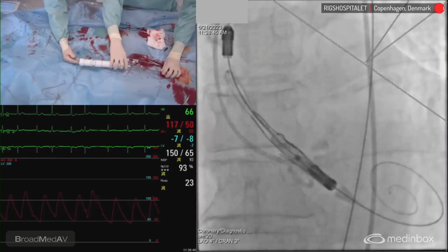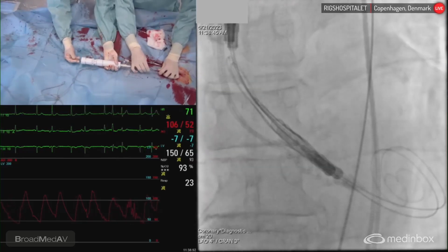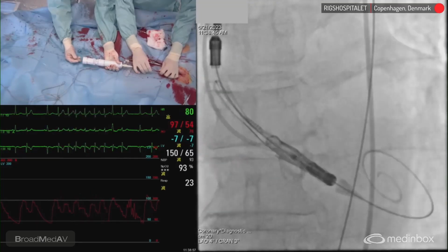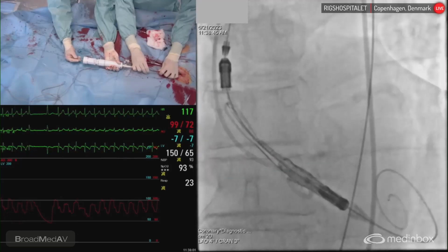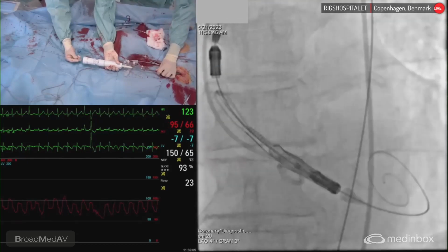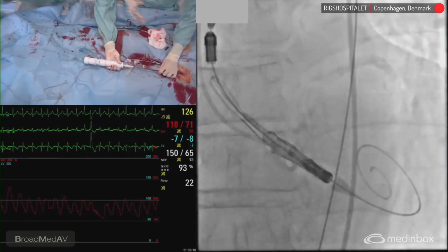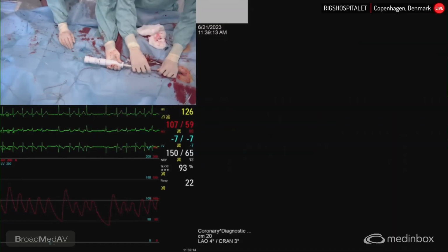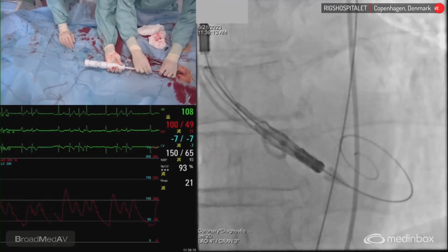All right, so we have to do this correct. You hold it. Yep. Okay, I'm staying for now in that tricusp coplanar view. I go slowly. And you see I'm completely on the outer curvature already. Can I have a dry one? Okay. Slowly some. I still have to go a tiny bit lower.